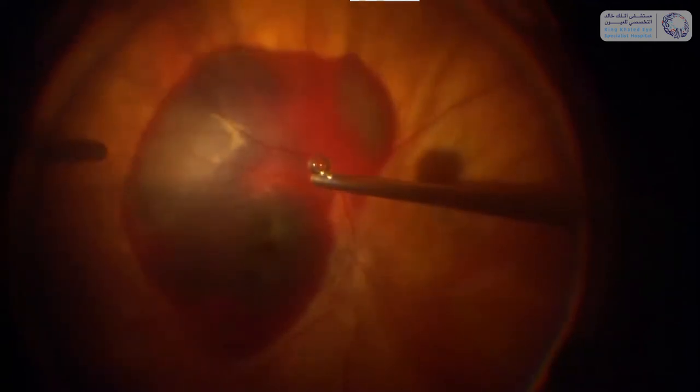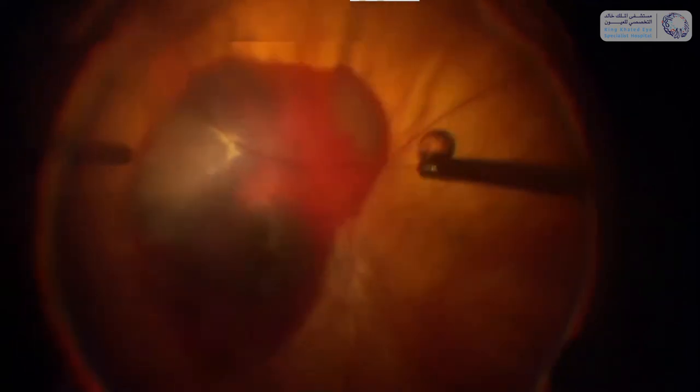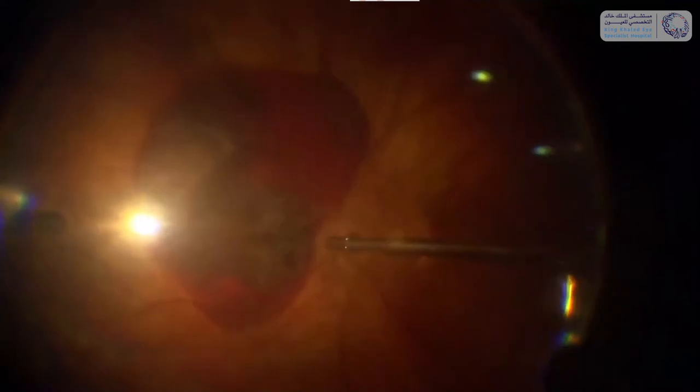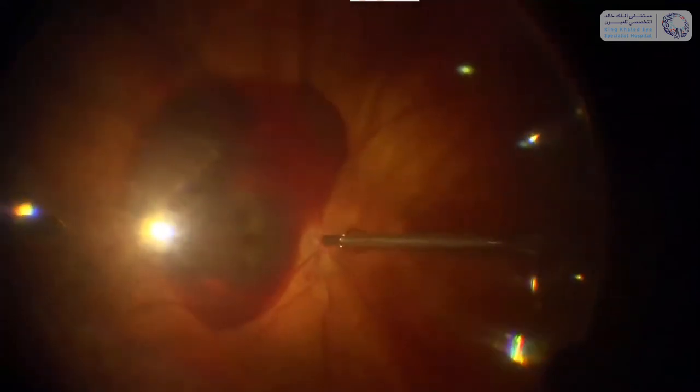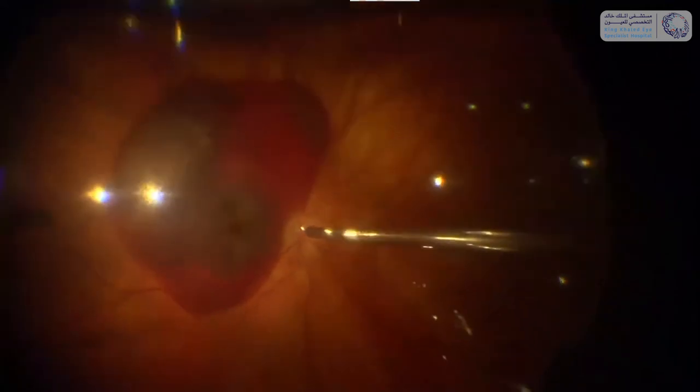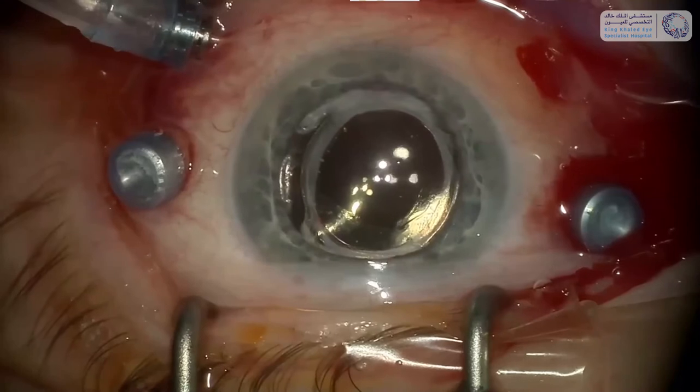What I'm doing is injecting in the lower area. This image is of course upside down. So we create some space in the lower area of the retina and the idea is to displace the liquefied blood into this lower region.